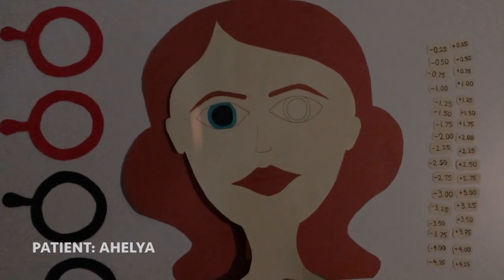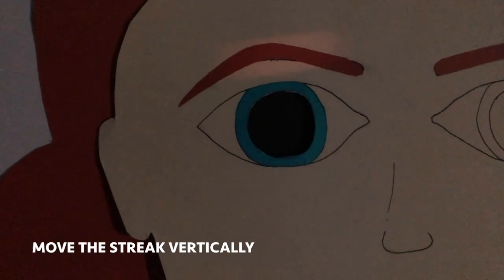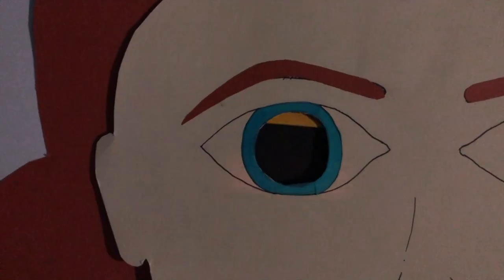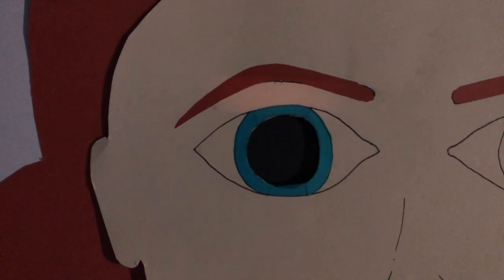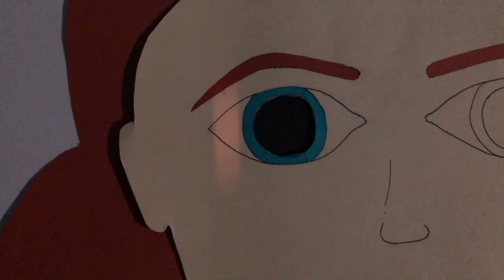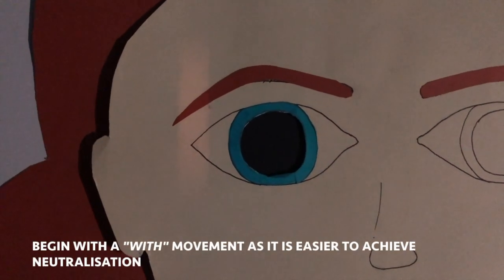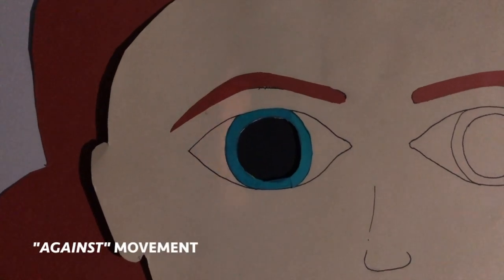Move the streak horizontally and then vertically. The streak produced from the horizontal movement depicts the 180-degree axis, and the streak from the vertical movement depicts the 90-degree axis. If the streak moves with the reflex from the retinoscope, this demonstrates a 'with' movement. If the streak moves opposite to the reflection, this demonstrates an 'against' movement. It is recommended to begin with a 'with' movement as this is easier to achieve neutralisation. Our patient Ahelia demonstrates an 'against' movement.